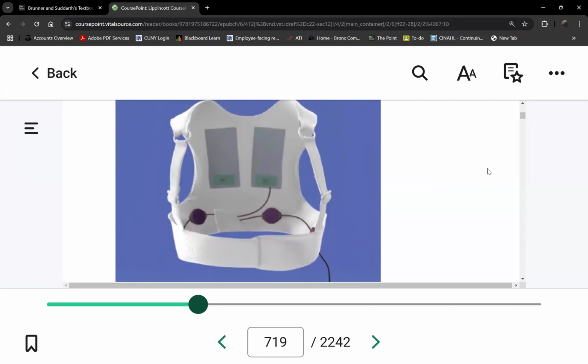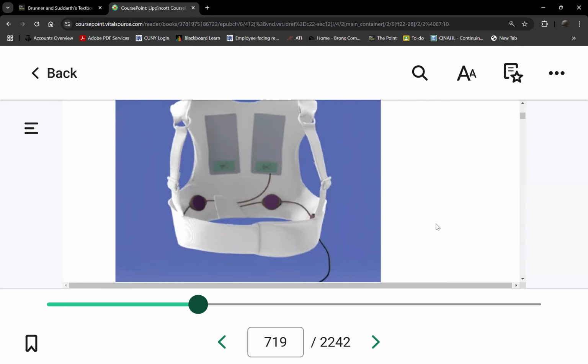Yeah, I mean, you've seen an AED. Is an AED only less than a pound? No, an AED is heavy because of the battery. If you don't want the battery, yes, you'll have to be plugged in somewhere. Plugged into your Tesla or any electric car. So we can do that. But you need a lot of power. Okay.